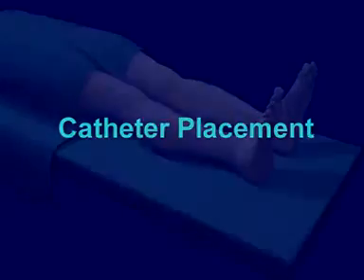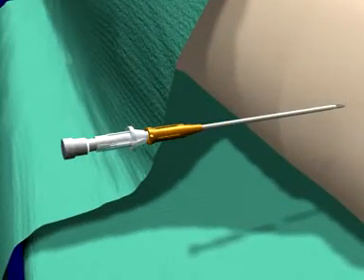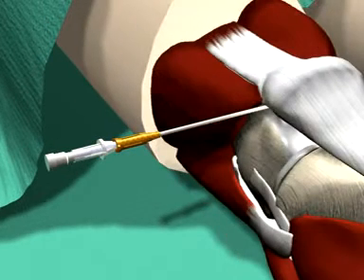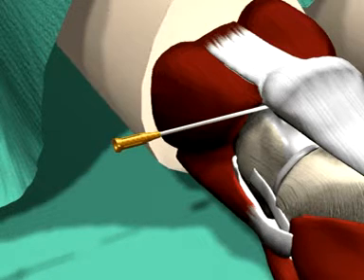Catheter placement is crucial for optimal pain relief. The catheter must be placed at the source of pain. To place the catheter, first insert the catheter insertion needle through the skin and into the wound site. Remove the introducer needle from the insertion catheter.